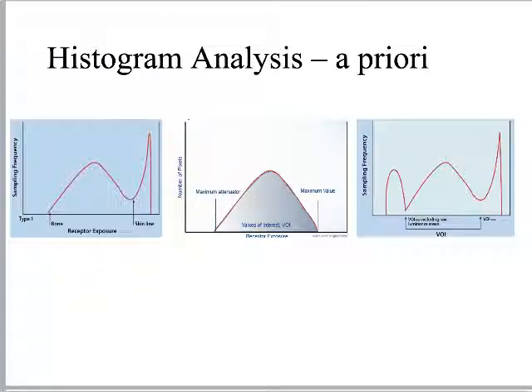So we don't need that. I don't need the black outside the patient's body to influence how the anatomy inside the patient's body looks, so we have basically X'd it out of the histogram. We're only interested in this little bell curve here in the middle. The stuff outside of the S minimum or the S maximum, not interested, right?